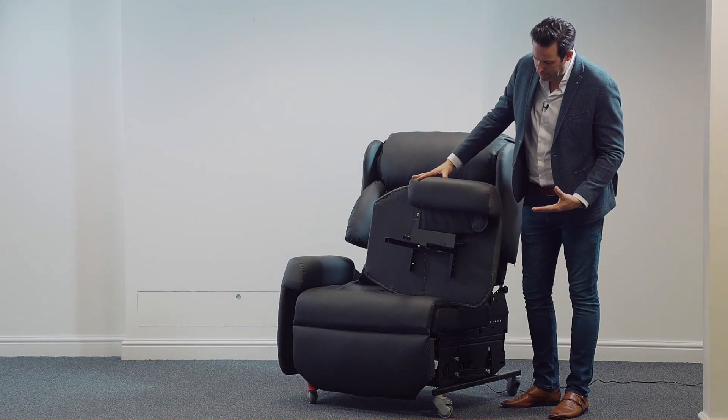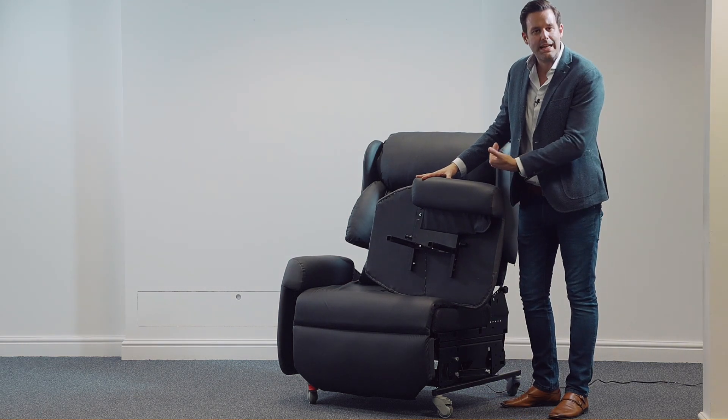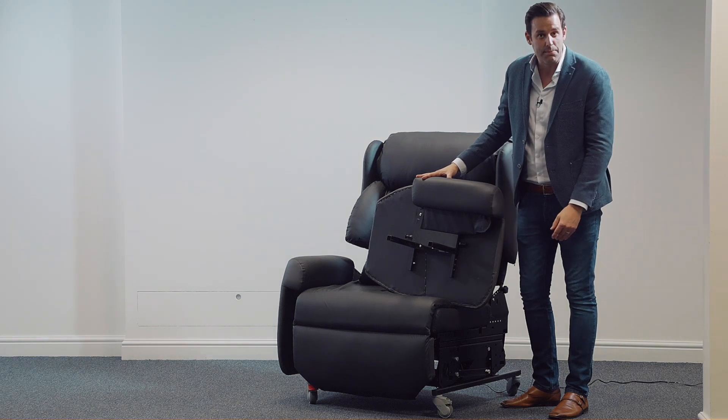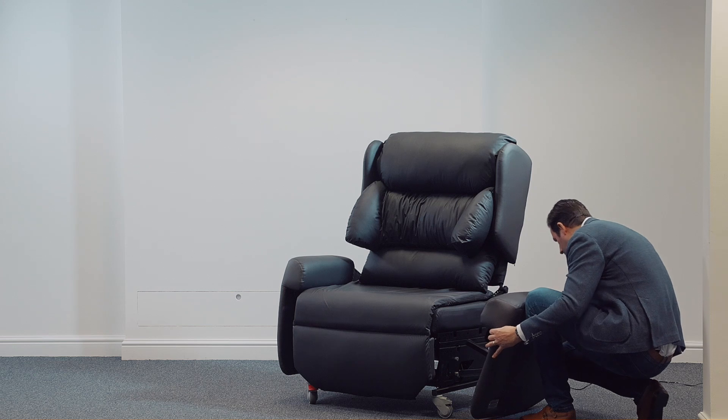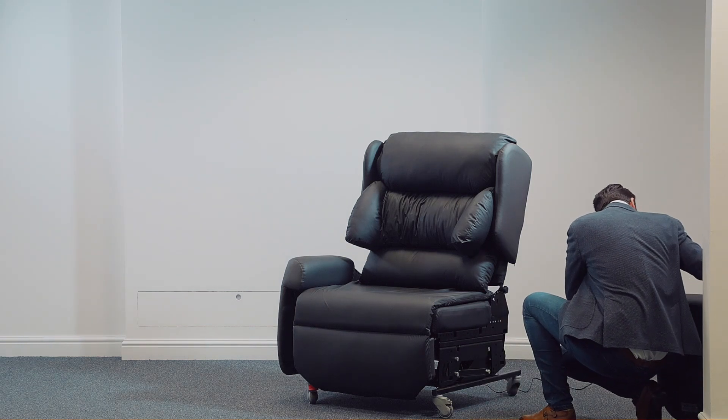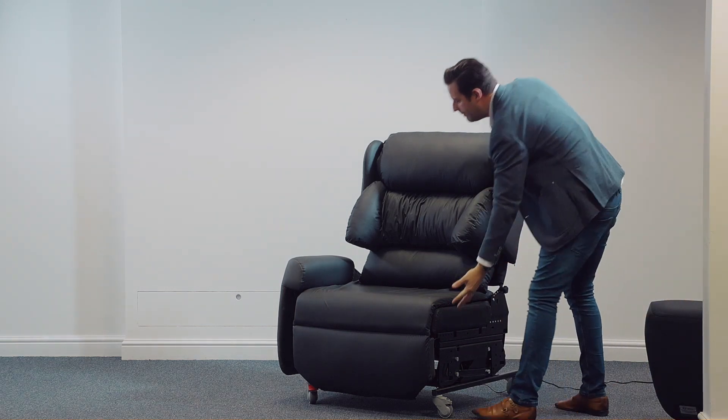The other major benefit of being able to remove the arm on either side is, of course, accessible side transfers. So let's just pop the arm to the side and I can demonstrate next.